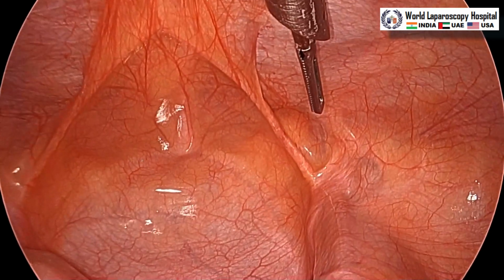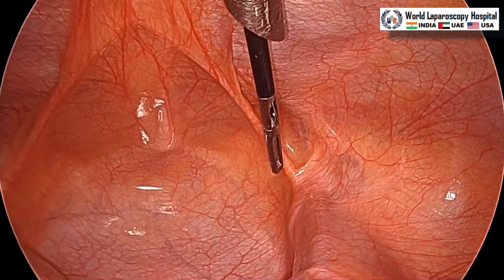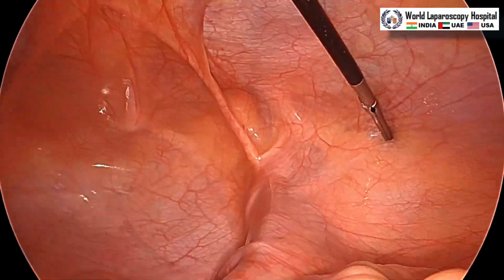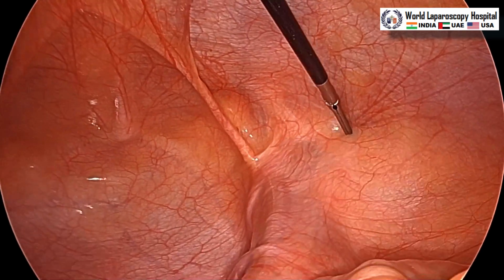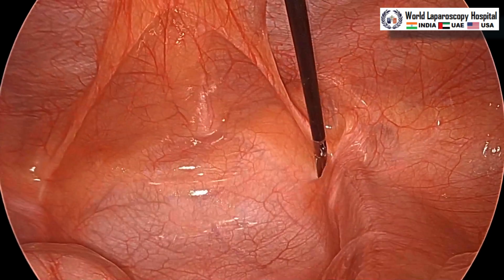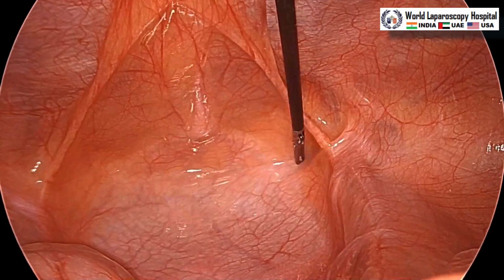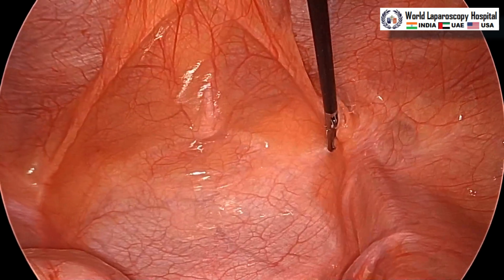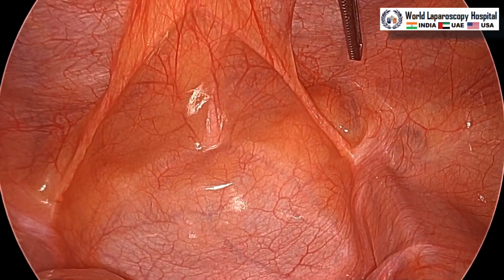This is the inferior epigastric vessel of the right side. Here will be the Cooper ligament. This is the inguinal ligament landmark which is going, but the inguinal ligament won't be visible by laparoscopy. Here should be the Cooper ligament, that is called the lighthouse, and when you reflect the peritoneum medially during hernia repair, you can see that.